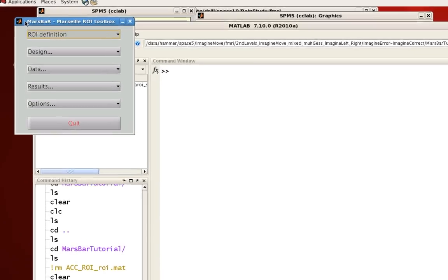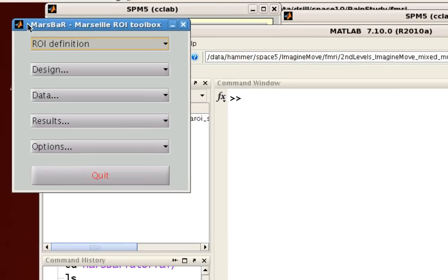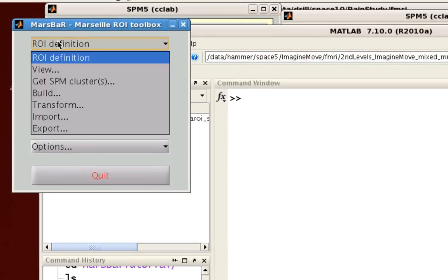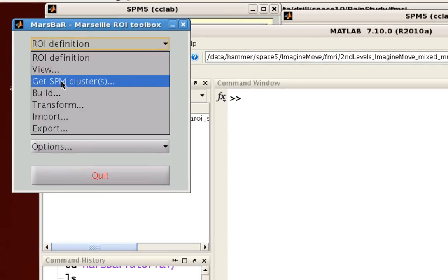So again, opening up MarsBar, click here on ROI definition, and then Get SPM Clusters.